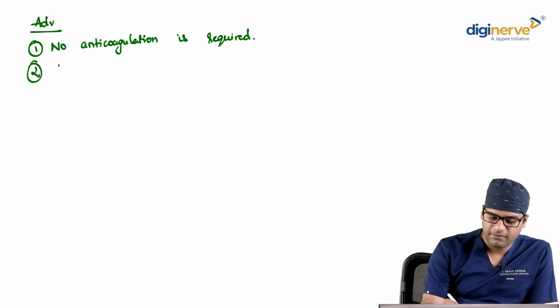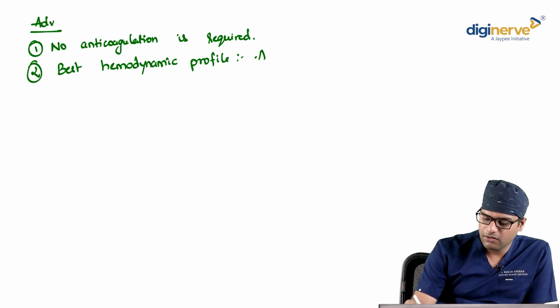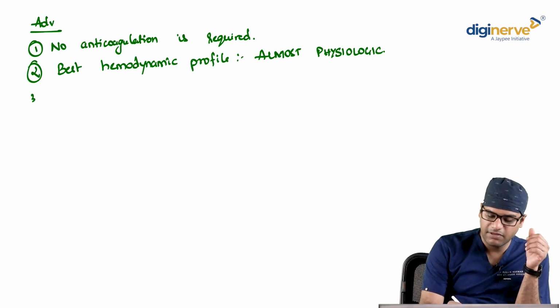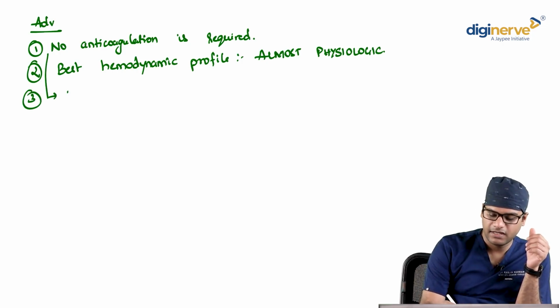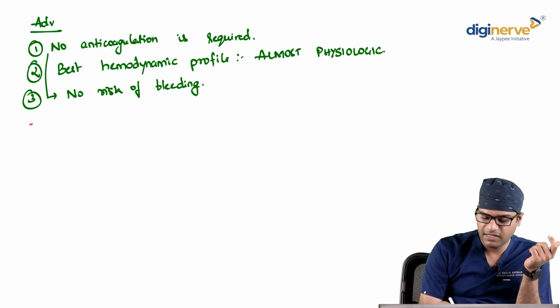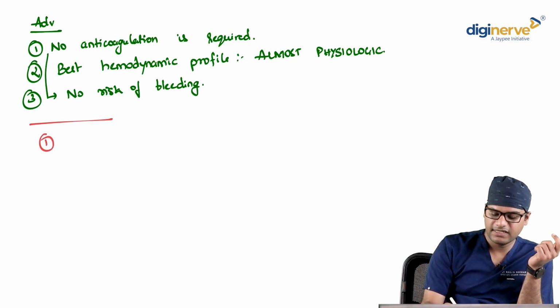Second advantage, best hemodynamic profile, because it is almost physiologic. Third thing, because there is no anticoagulation required, no risk of bleeding. The only disadvantage we are going to speak about is early structural degeneration.